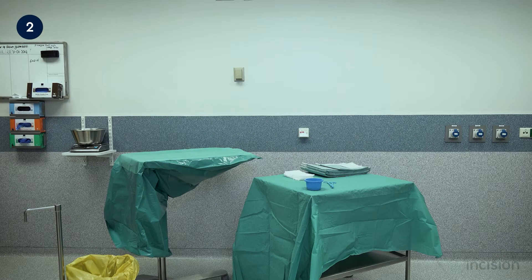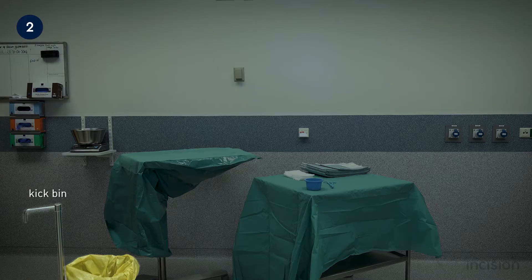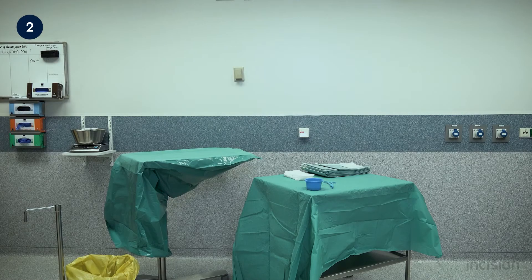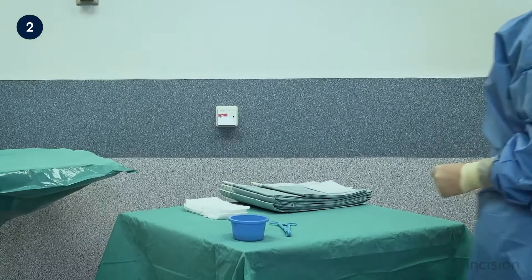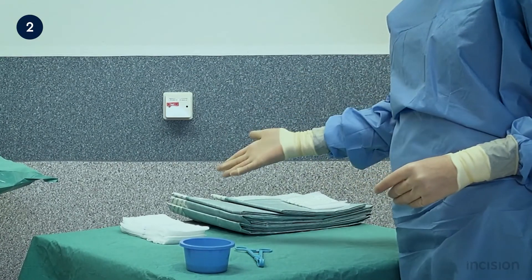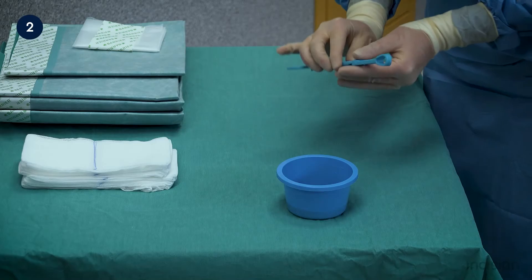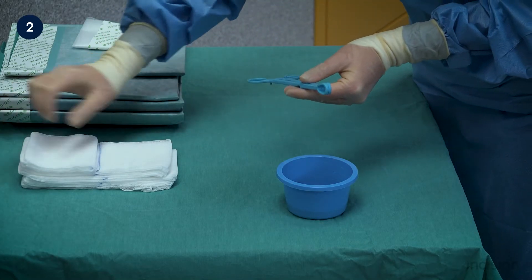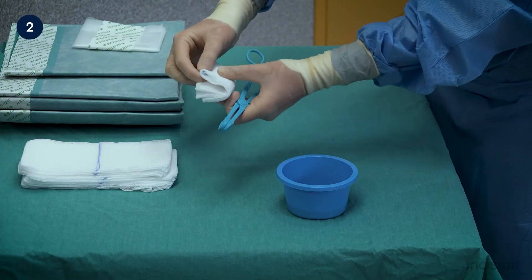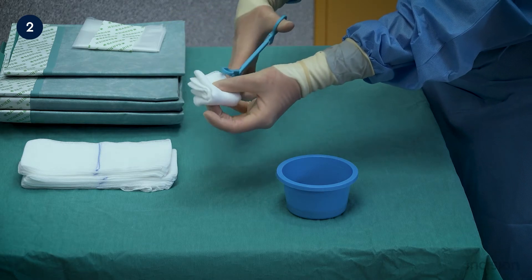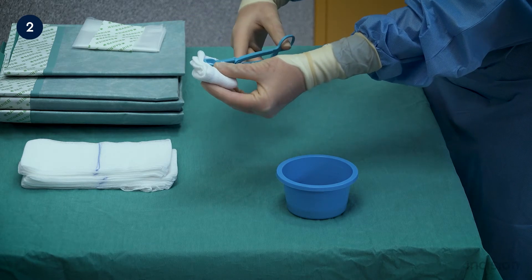Take note of the OR furniture: a kick bin, a mayo stand and OR trolley on which clean implements and drapes have been prepared. Take note of the drapes, sterile gauze swabs, clean container and clamp. An example of how to load the clamp is now shown. A gauze swab is folded and then placed into the teeth of the clamp. This can then be used to clean the patient.